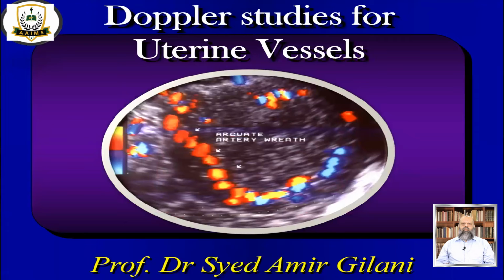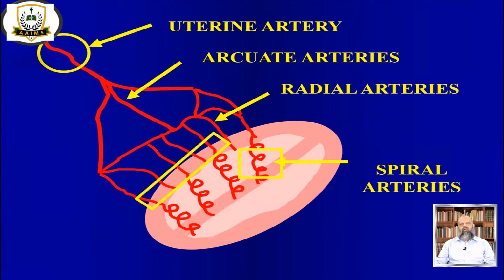Good morning. I am Professor Dr. Syed Amir Gilani, and today we are going to talk about Doppler studies of uterine vessels. The uterine vessels are very important to be assessed, but they are usually ignored by most ultrasonologists. We need to know there are main vessels.